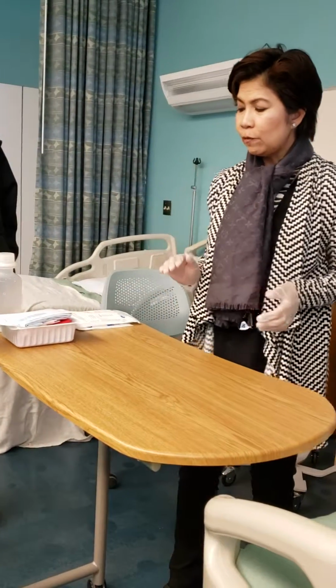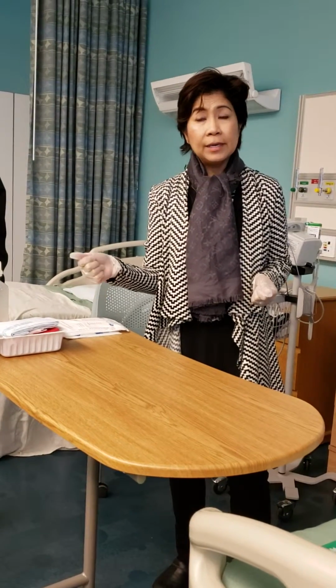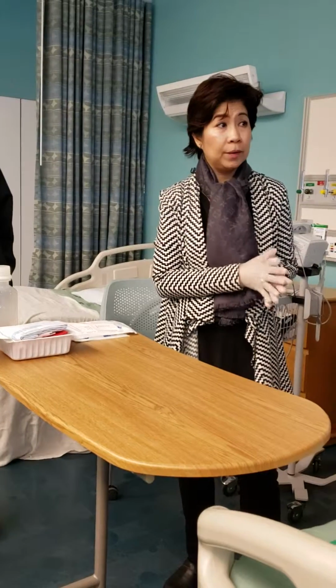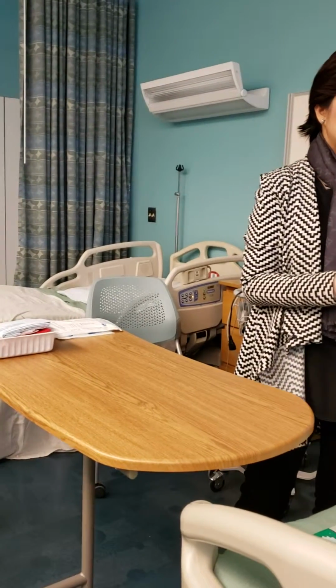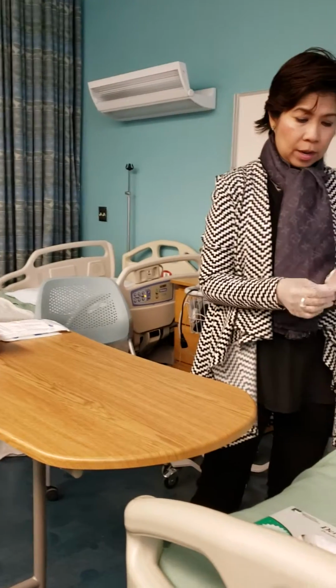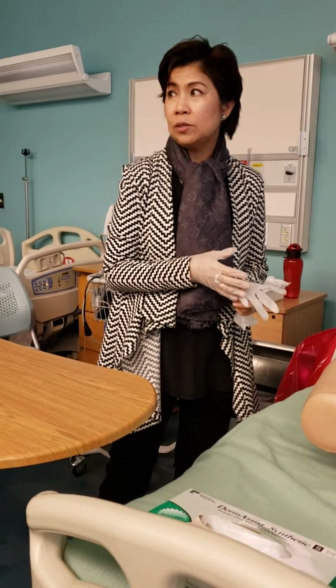I open it away from me, and the first thing I see is the sterile drape. I can either touch it with my clean gloves, I can touch it with my bare hands, okay? But since I touched this wound dressing, I can go ahead and take this off and throw it away. I usually change my gloves because I don't know what I'm touching.